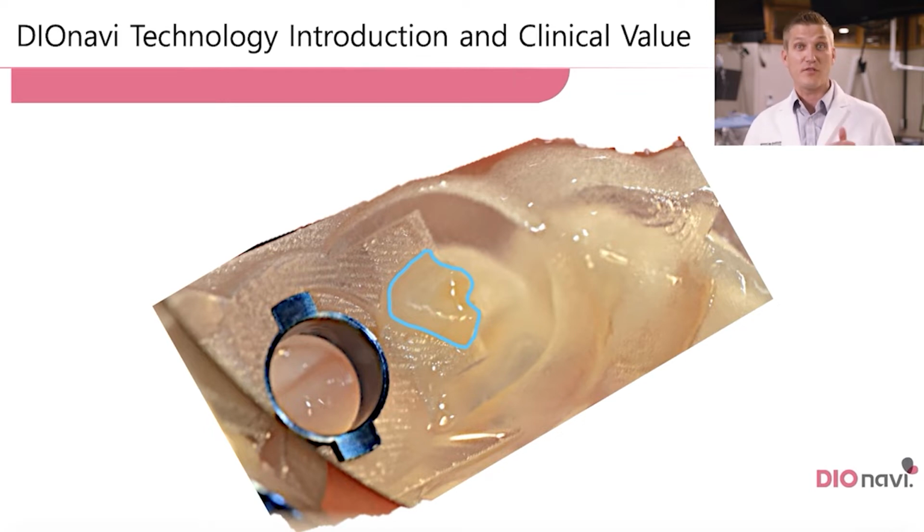At the end of the day, we can thoughtfully plan our implants, we can tweak it all we want in the virtual world, but if that physical guide does not seat properly with precision, all of that thoughtful planning in the virtual world will not translate to any type of clinical benefit. And so I really appreciate a wonderful fitting guide, really, really important to a final outcome that we're really proud of.